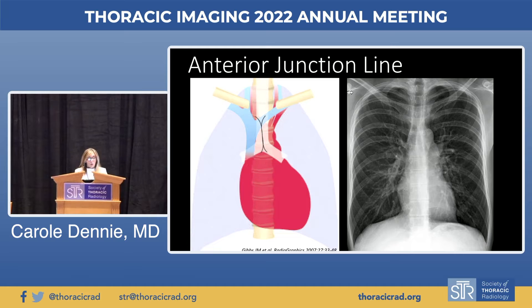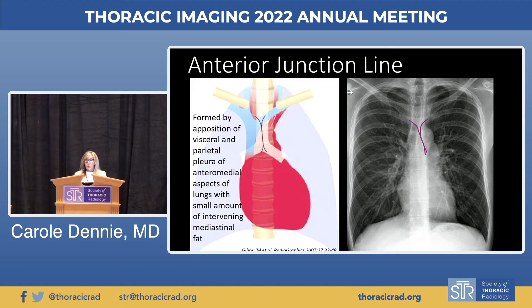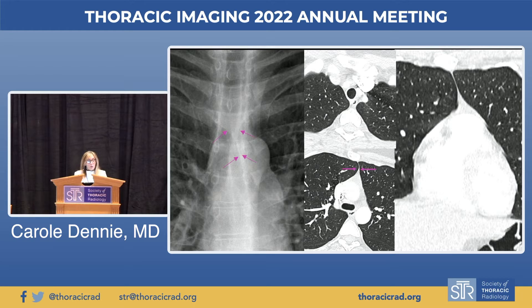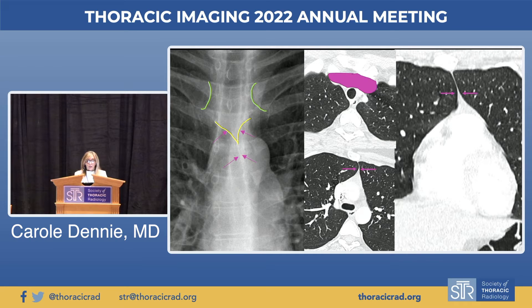Let's start with the anterior junction line. It's formed by the apposition of the visceral and parietal pleura of the anteromedial aspect of the lungs with a small amount of intervening mediastinal fat. It may look like a stripe when there's a lot of fat in the mediastinum or when there is intervening thymic tissue. We see this oblique line with a V-shape at the top where it becomes separated by mediastinal fat and great vessels superiorly. Note that it doesn't go above the clavicles.